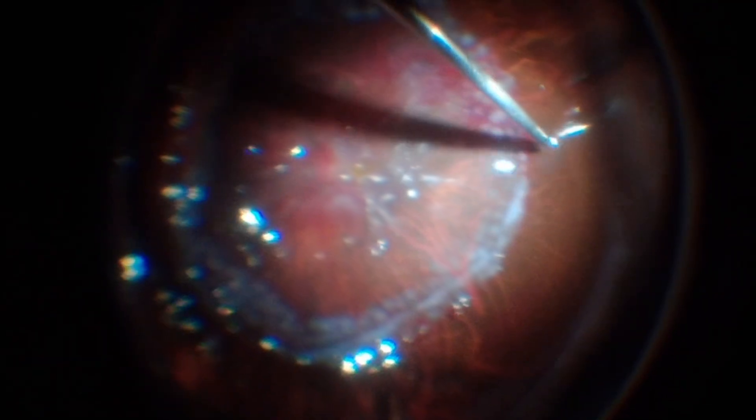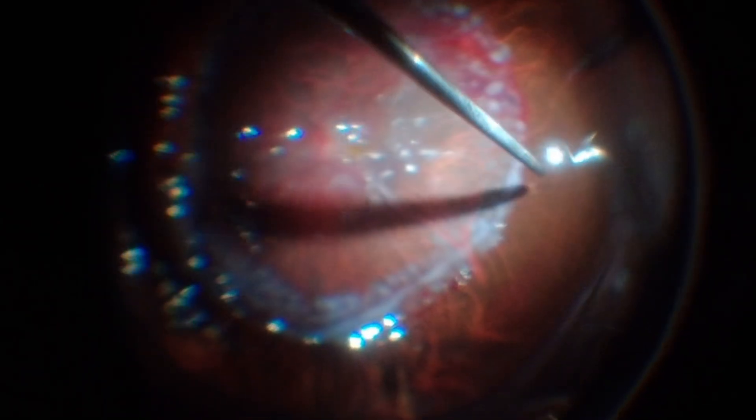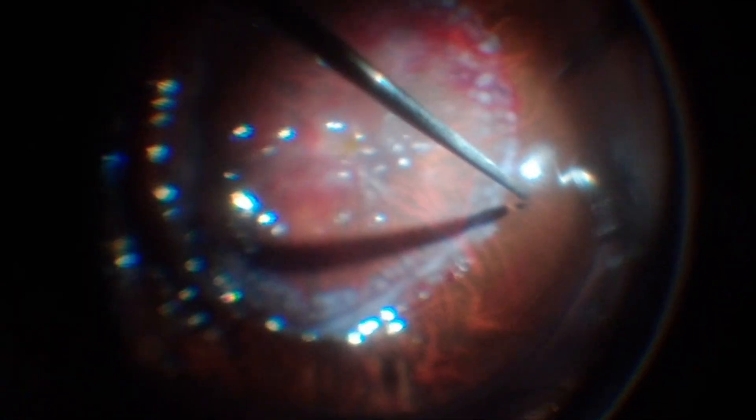Finally, a fluid-air exchange is carefully performed to avoid retinal slippage, and the vitreous cavity is filled with silicone oil.